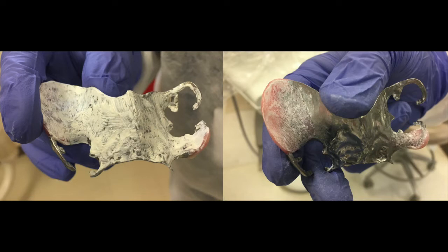The left side is incorrectly applied PIP. Also, it is very important to note that there is no need to apply PIP on the metal framework. The left picture shows PIP applied all over the metal framework, which is incorrect. On the right side, PIP is carefully applied only on the denture acrylic portion, not on the metal framework.